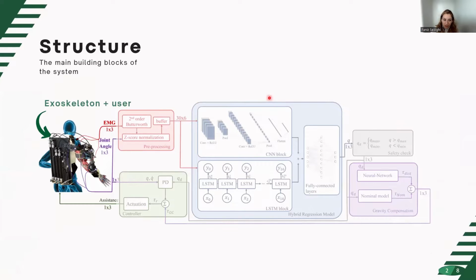This is the main structure of the system. I'm going to start with the user interaction with the hardware, which is the exoskeleton, and then move forward to the other components of the system later.